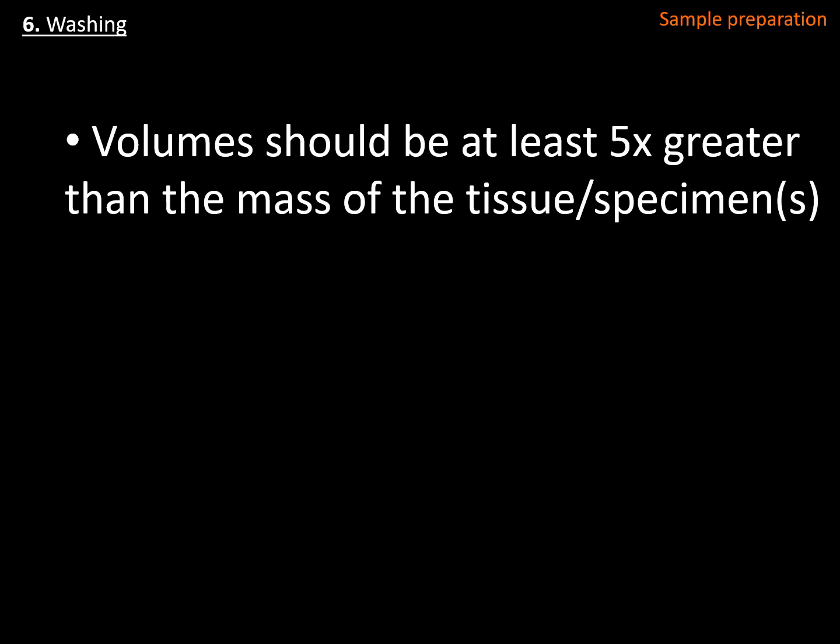After washing, you are using very high concentration solution of antibodies. So this means that even after you take out the antibody solution, you are going to have antibodies that are just stuck to other proteins that are not your target. So you have to wash extensively in order to remove all of this. As a general rule of thumb, I always use at least 5 times greater volumes of washing solution than the mass of the tissue that I want to wash.